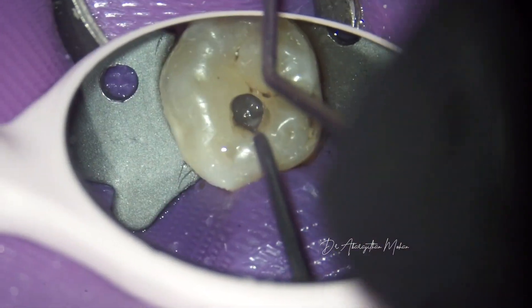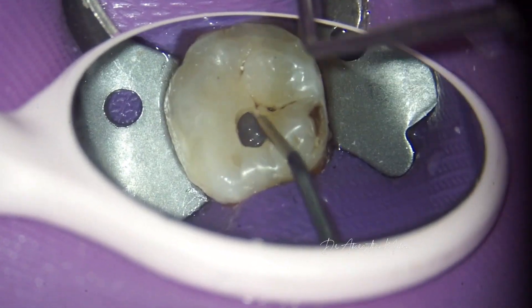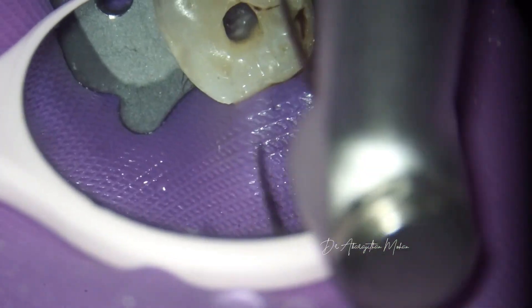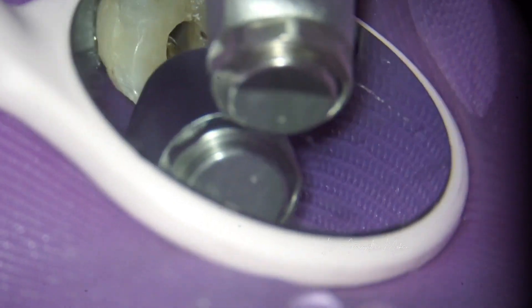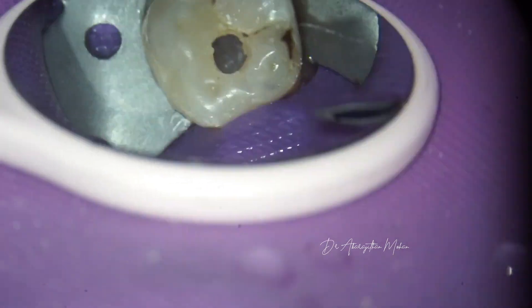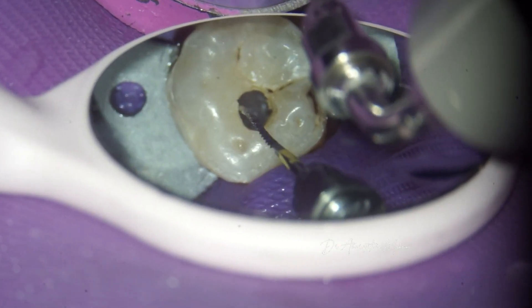We locate the orifices with the DG16 probe. There are four canals: mesiobuccal, mesiolingual, and two distal canals. Heat-treated files are used, which can be pre-bent and easily placed into the orifices. All four canals are shaped with size four taper files to preserve the pericervical dentin.